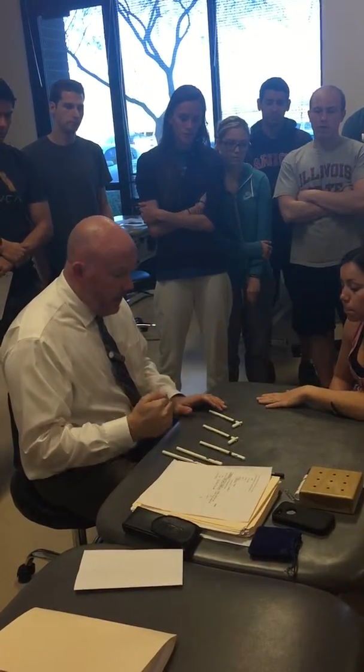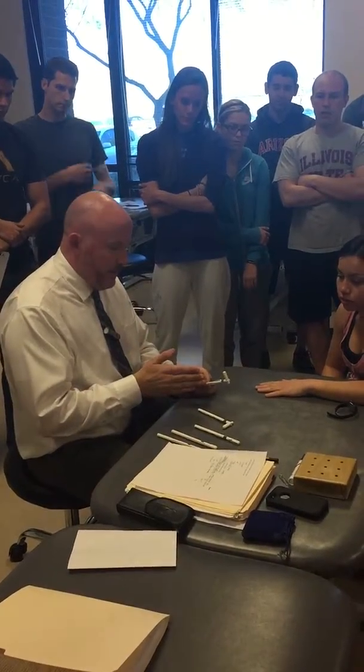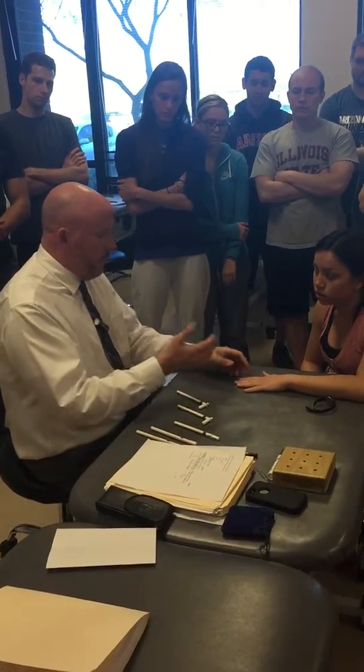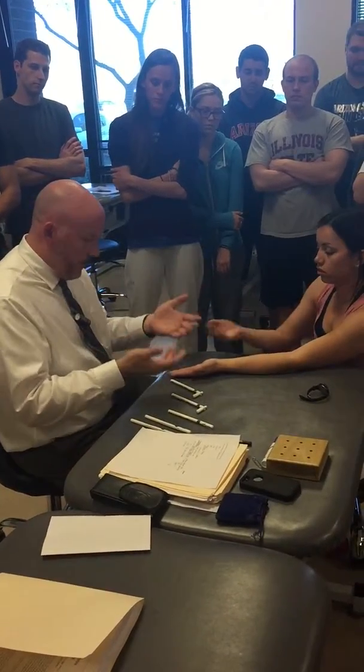and that will tell me the difference in how much of a loss of sensation there is. So when you look at it, and they're color-coded, this is, again, uniform. The green one is the smallest of the monofilaments. This would be considered normal sensation to light touch. And if we're dealing with the median nerve distribution, I'm going to do this with both arms, but I'd have her across the way.